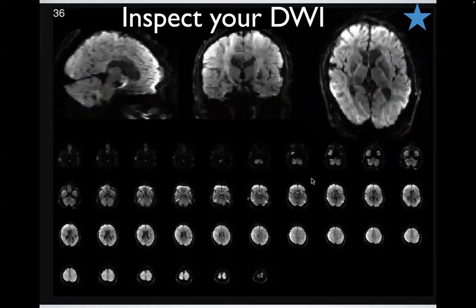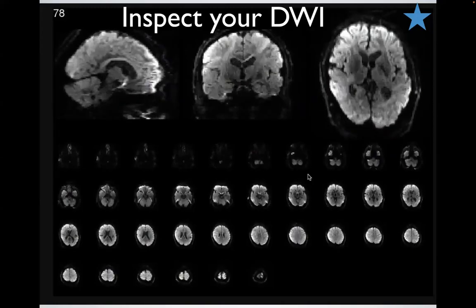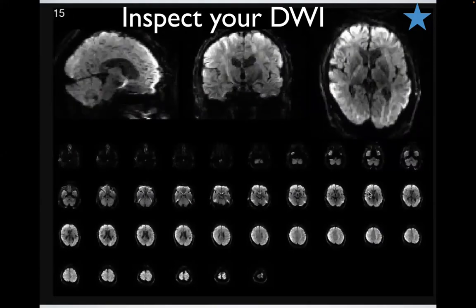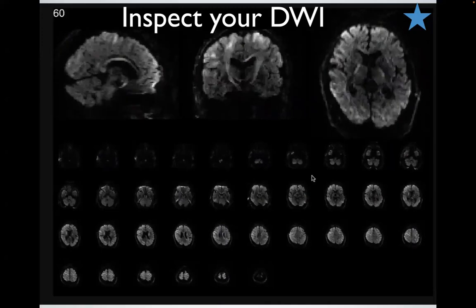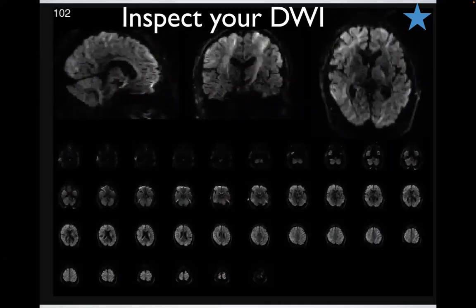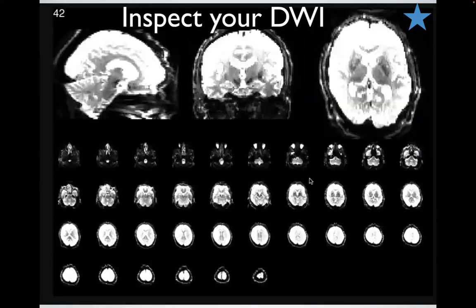This is a healthy brain. Look at this crap here. What is this? And this part of the signal, why is it always more bright? Or the top of the brain here is more bright than the bottom. Okay, this is real life science. This is where it's very hard to simulate this. These are artifacts of the acquisition.